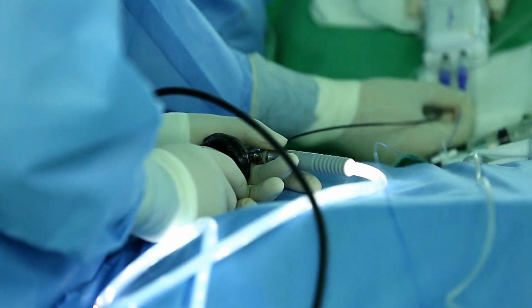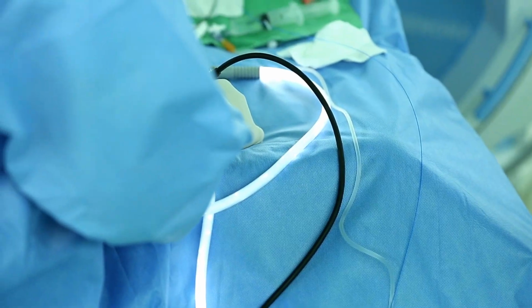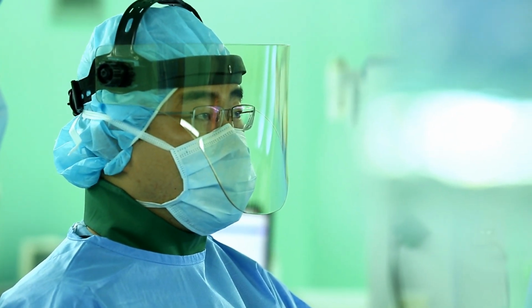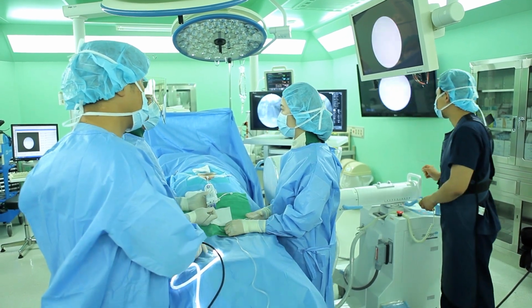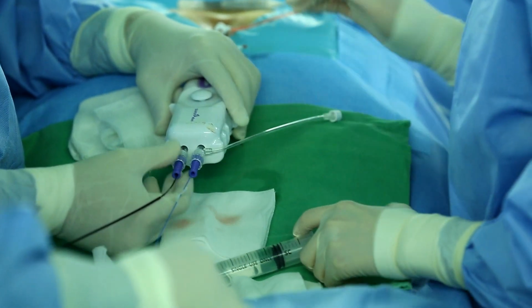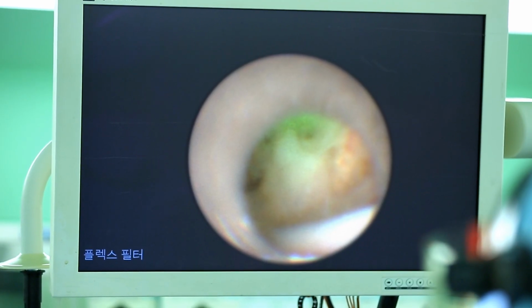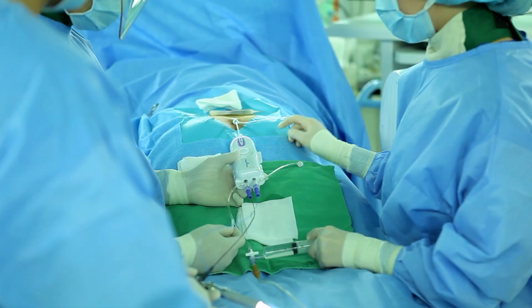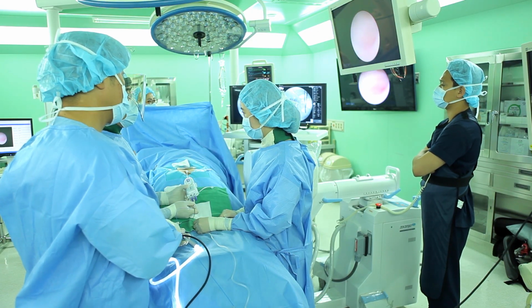The endoscopic cable is a consumable. As it is being used, the resolution will get poorer and poorer. The skillfulness of SELD will make an impact on its shelf life. If it is of too low resolution to be used, it should be replaced. If not, you may clean the view by pushing saline. If the view is interfered with by epidural fat, you may repeatedly insert and take out the endoscopic cable while pushing saline to remove the epidural fat.